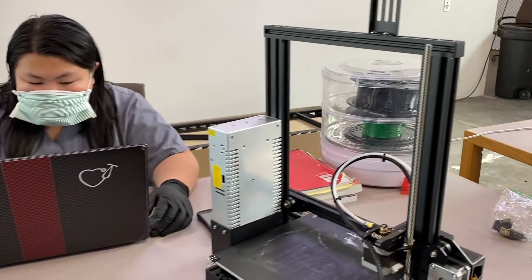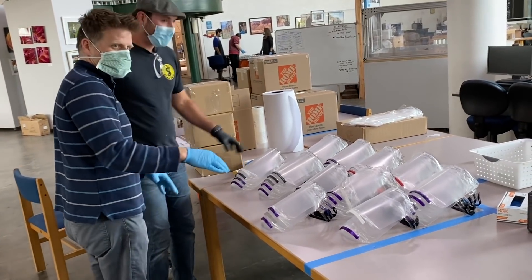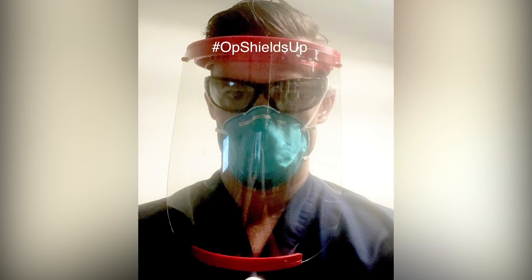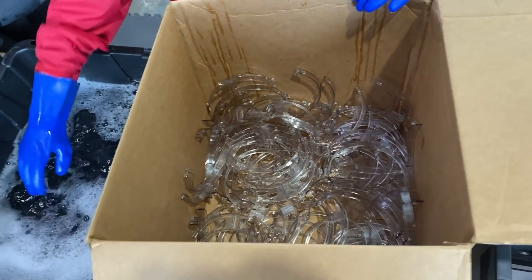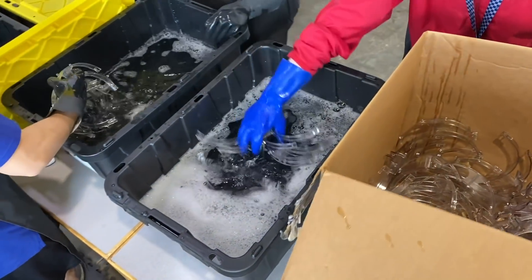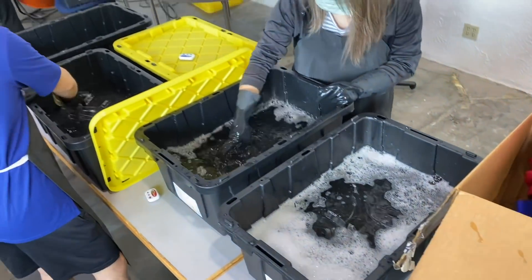The problem is 3D printing is a slow process, so we have to throw a lot of machines at it. We've got a lot of people handling all the logistics — getting the packaging together, the laser cutting done, getting our hashtag on there so we can get the word out. We take safety very seriously, so we start by disinfecting everything we get per CDC standards for high-level disinfection.